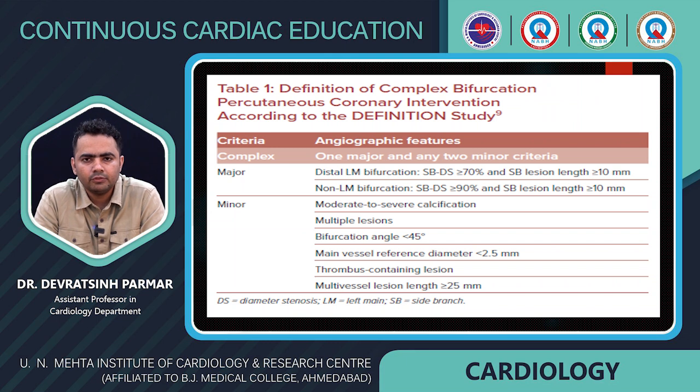Okay. So bifurcation PCI is again divided into two: simple and complex bifurcation PCI. Now the definition of complex bifurcation PCI has come from the DEFINITION study. It has both major and minor criteria.